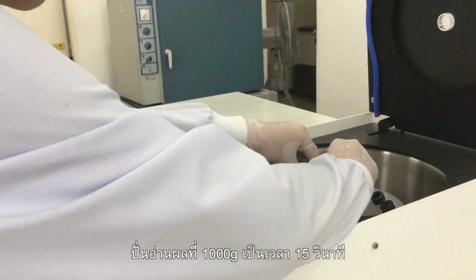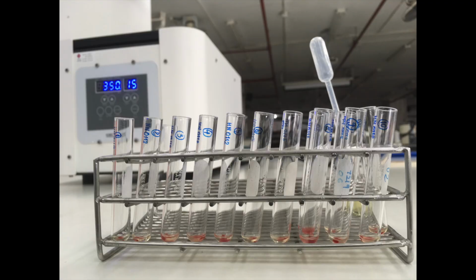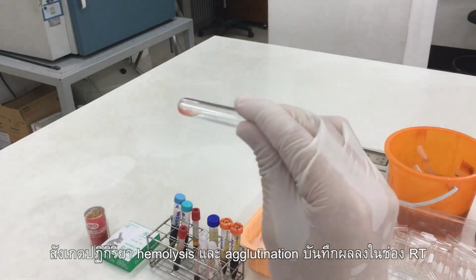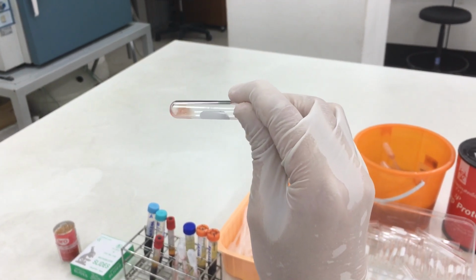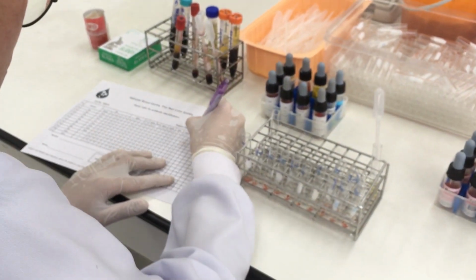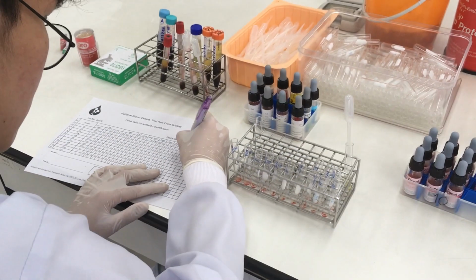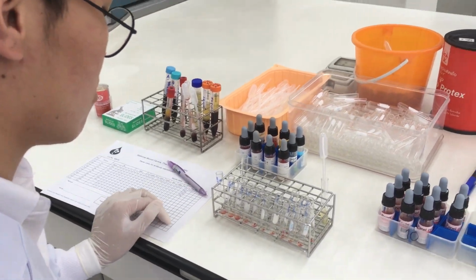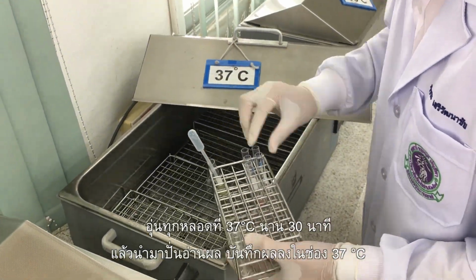Centrifuge at 1000 G for 15 seconds. Observe hemolysis or agglutination and record in the RT phase. Incubate all tubes at 37 degrees Celsius for 30 minutes.